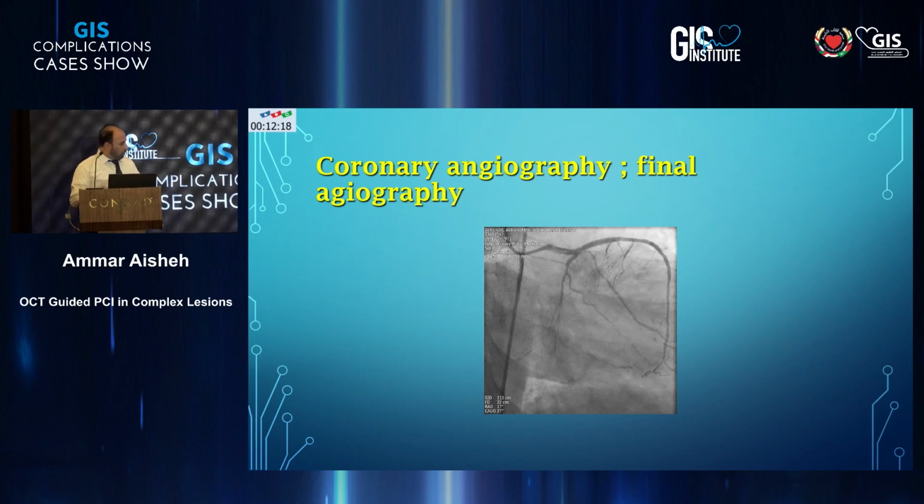So Mohammed, you already started this, and we'll go back to you. Other than pre-dilatation, is there any other point you want to make in this approach in the LAD? No, I think preparing the lesion is quite important. When you see the fibrotic tissue, and we've seen this many times, the recoil and the expansion of the stent is always very difficult. This is one of the areas where I would use a cutting balloon, because you could score that area, and then you're able to dilate it.